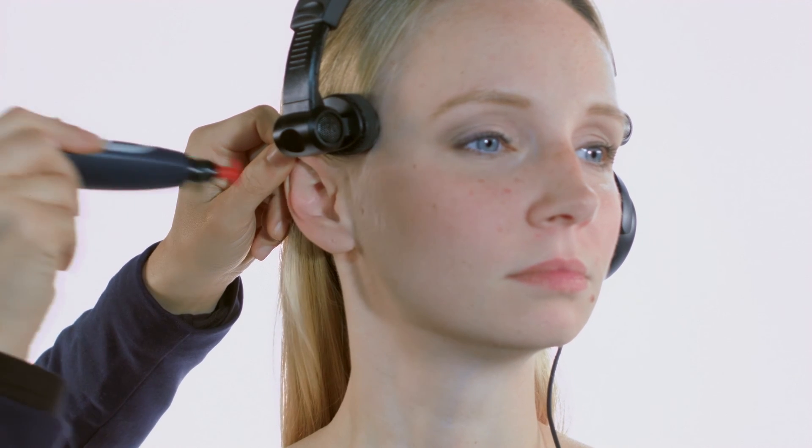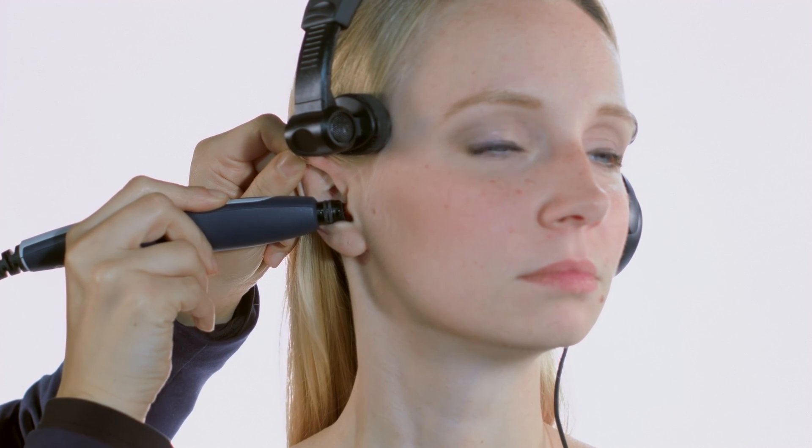Hold the probe still until all measurements are finalized.